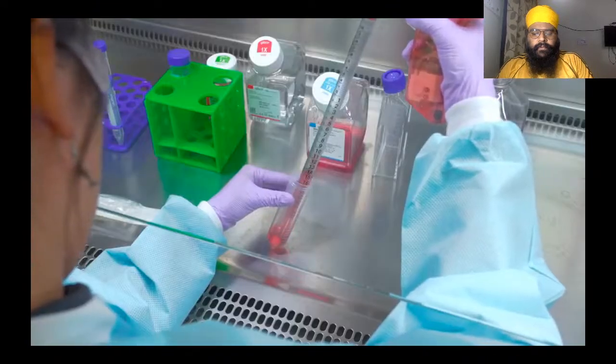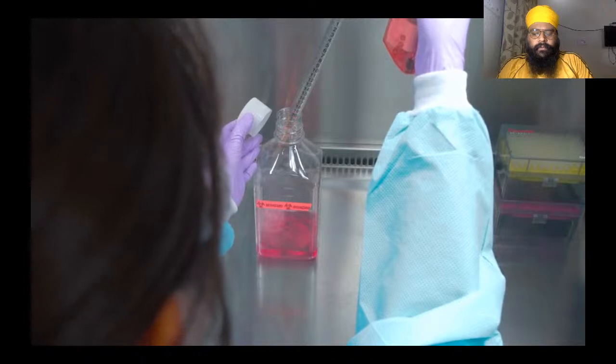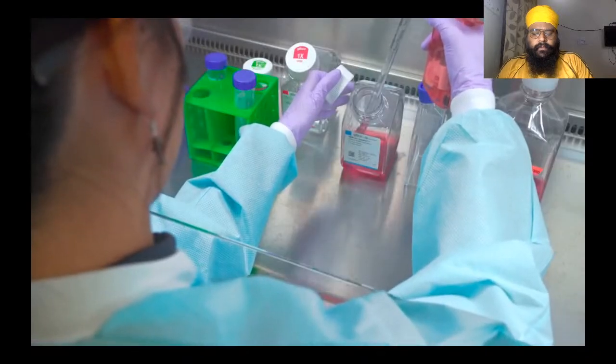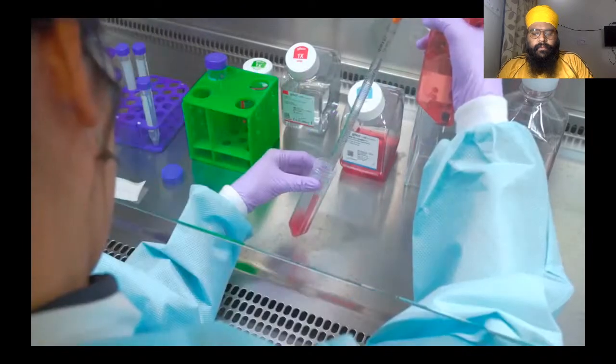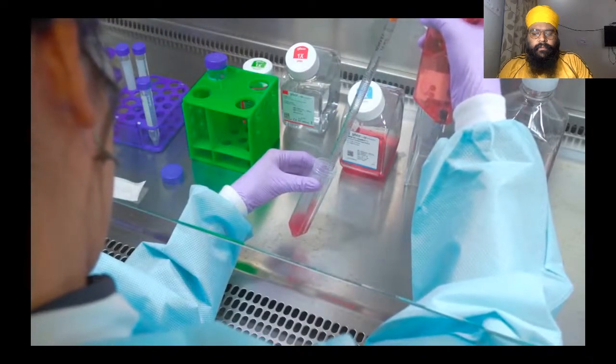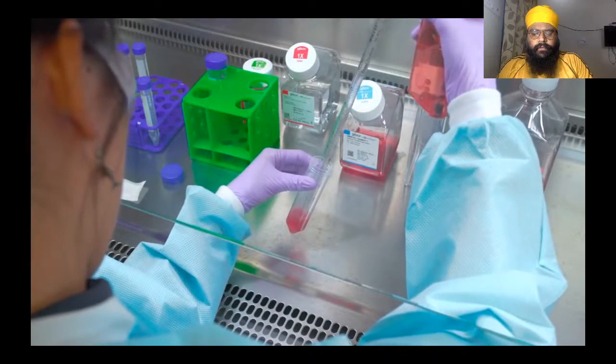Remove the medium from the centrifuge tube with a pipette and discard the medium into a waste container. Try not to disturb the pellet. Resuspend the pellet with warm, complete growth medium. Gentle pipetting will disperse the cells to ensure a homogeneous solution of single cells. Remove a small sample for cell counting.